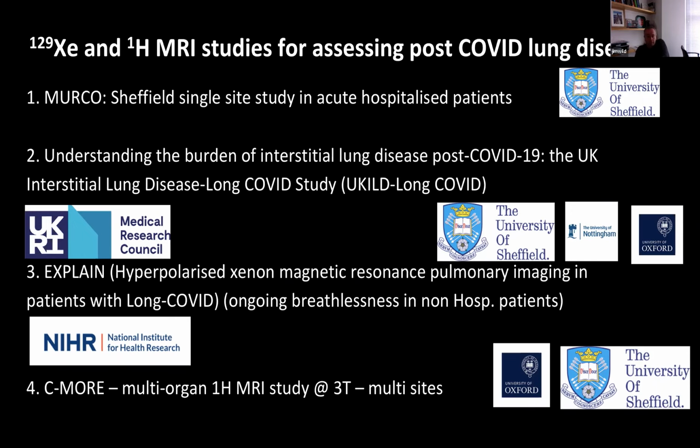But pilot data from that study has already been published. That's a study that we've done in collaboration with Fergus Gleeson at Oxford, where we're looking at post-COVID patients. So patients who seem to have quite normal CT, no structural abnormality, but are complaining of ongoing breathlessness post-COVID infection. So there we're looking at long COVID patients with breathlessness essentially.